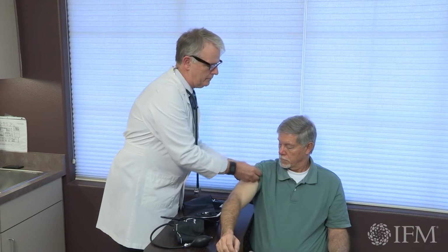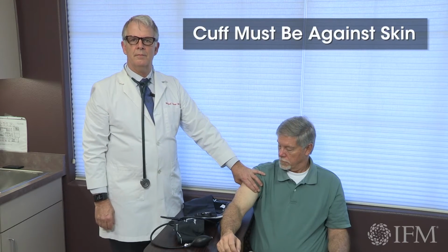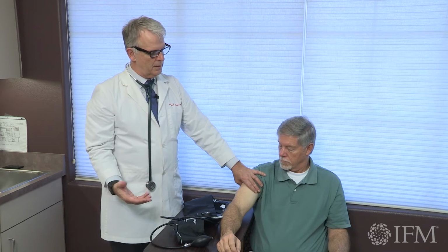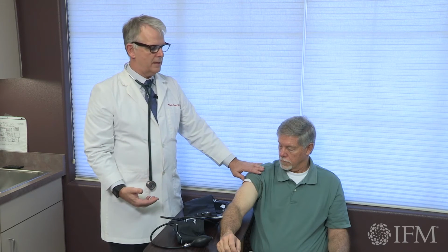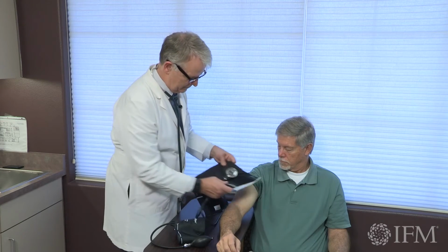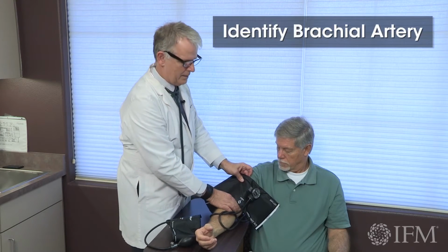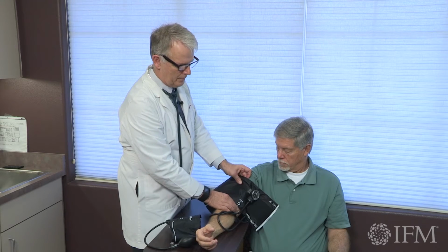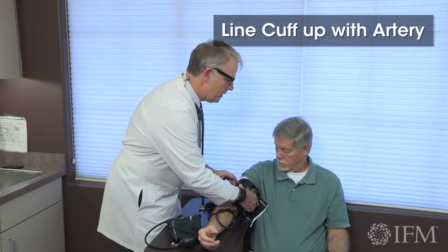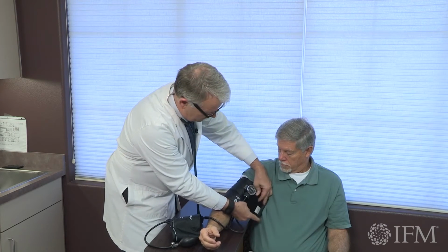To put the cuff on, you want to make sure that you have easy access to a bare arm. So if somebody is in tight wardrobe, a tight shirt, a tight sweater, you'll have to put them in a gown. This is ideal. He has a knit shirt that we're able to pull up right to his axilla. In placing the cuff, you want to make sure that when you palpate the brachial artery, the artery indicator is approximately over where the artery is, and then you fold the cuff so that you have good purchase of the Velcro.